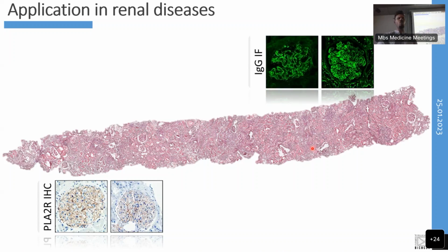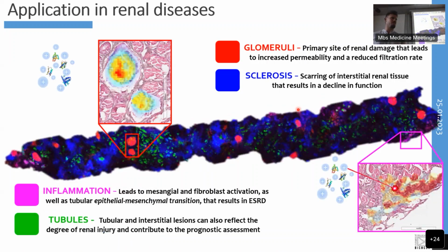But what will happen if we take the same renal biopsy and we apply MALDI imaging technology? So in one single analysis, we will generate hundreds of proteins, each of which correlates with a specific feature within that kidney. So we will detect tens and hundreds of proteins which co-localize to the glomeruli and the severity of lesions which might be present within there.